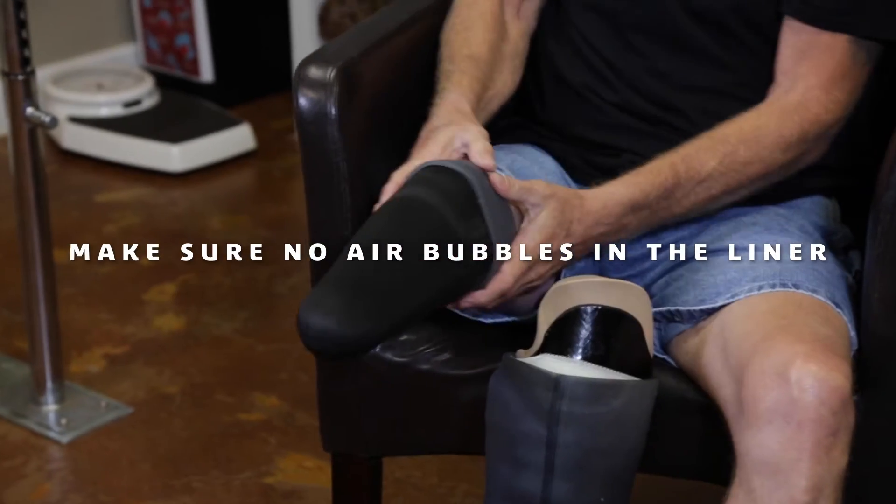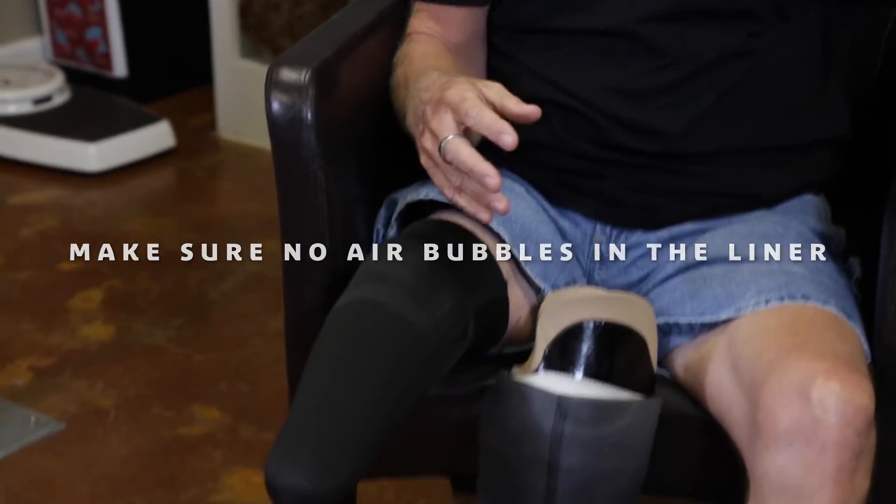So if you don't mind, John, would you show everybody how this goes together. There's the liner — he's going to put that on his leg and roll it up so there are no air bubbles in it. And he's going to use a three-ply sock, is that right?